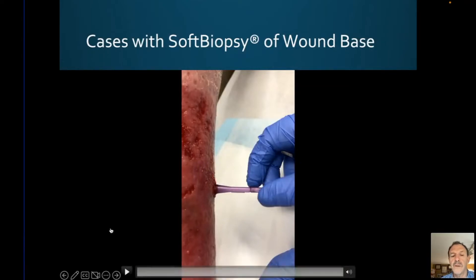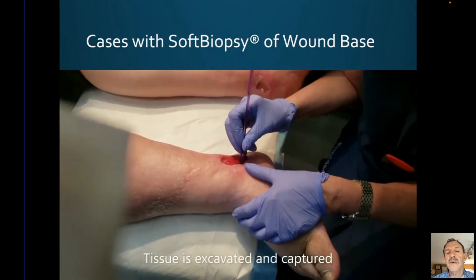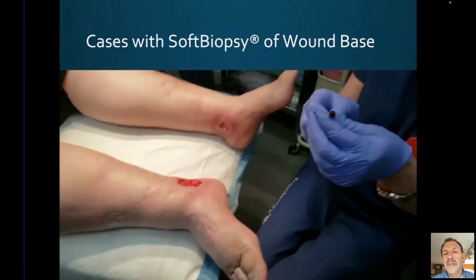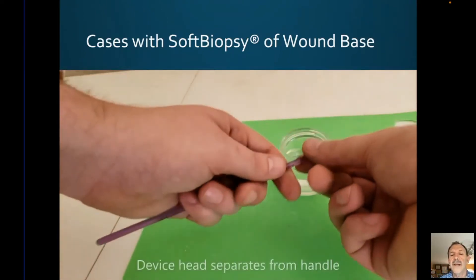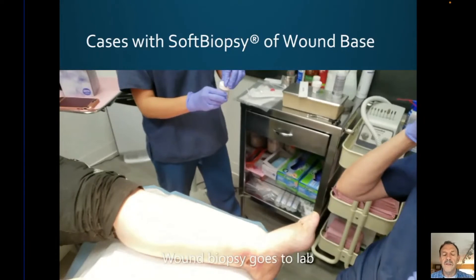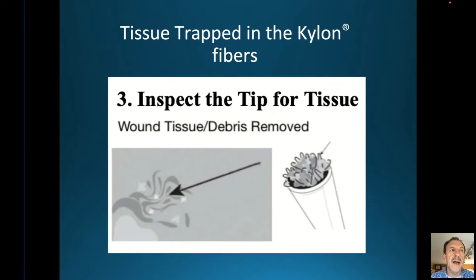The video shows a key-turning motion with moderate pressure — that was a venous ulcer. This is a mixed diabetic foot ulcer that's already been debrided, and now the clinician is taking a focal biopsy, showing tissue trapped in an array of hooks. That's just a demonstration of what you do next — you'd snap it off. That's for histology, but this one is for molecular testing. The wound biopsy goes to the lab. Your goal is to get tissue trapped in the hooks and leave micropunctate bleeding behind.